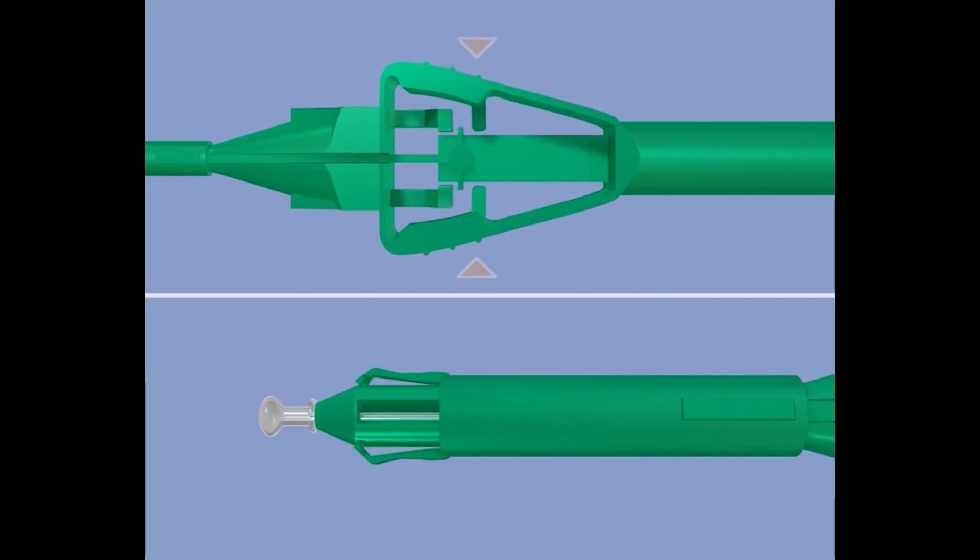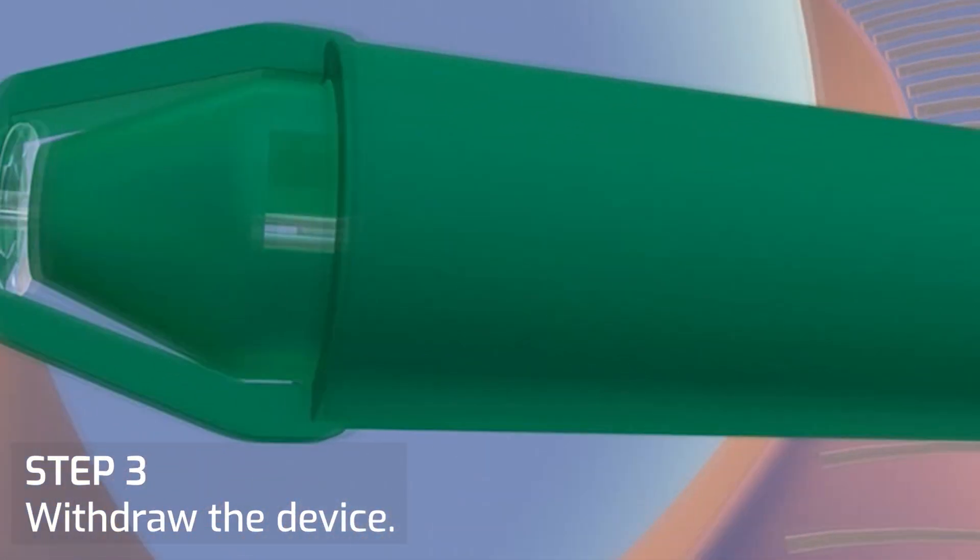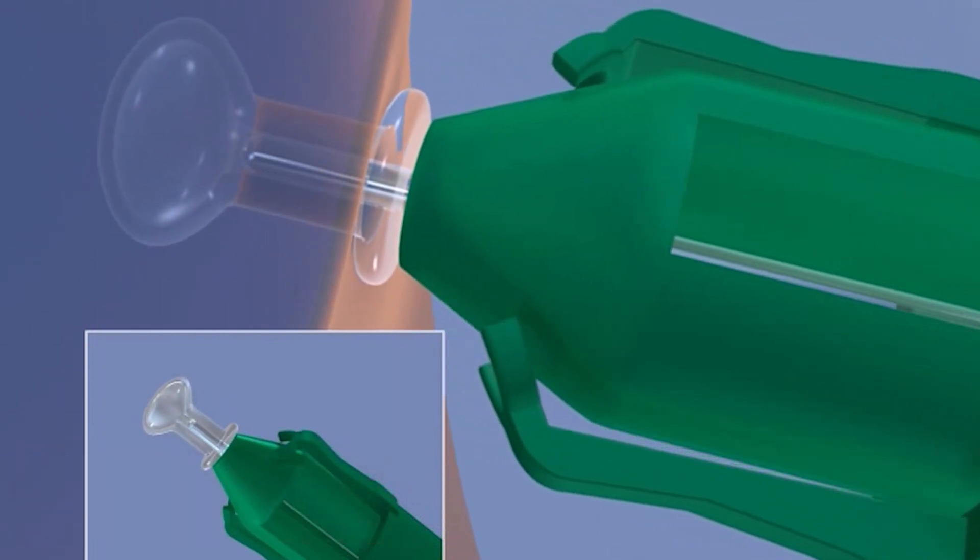This step is essential for a smooth and complete release of the plug. At the same time, the needle retracts and releases the plug which takes its final shape in the ampulla.